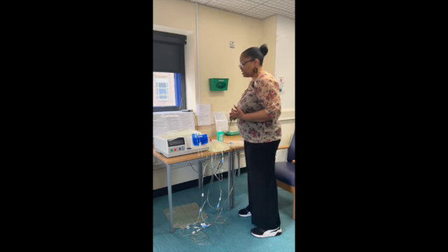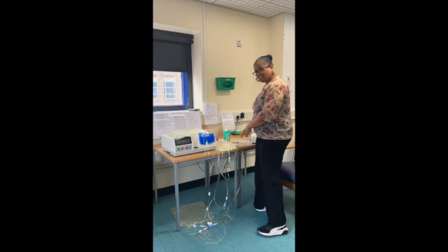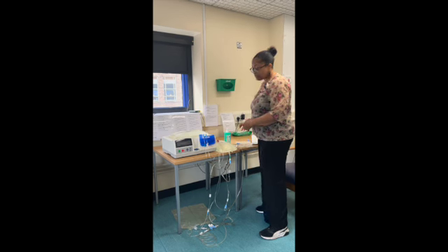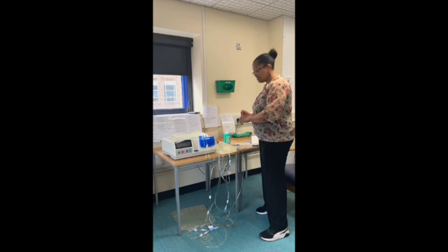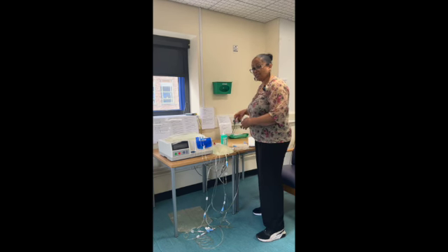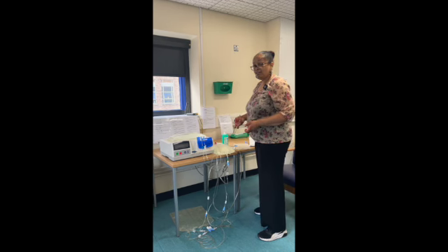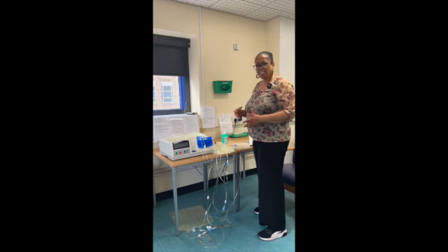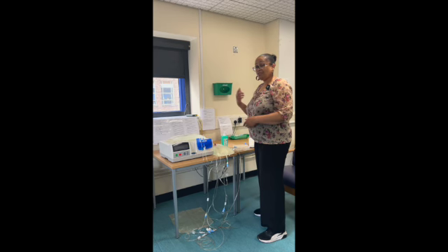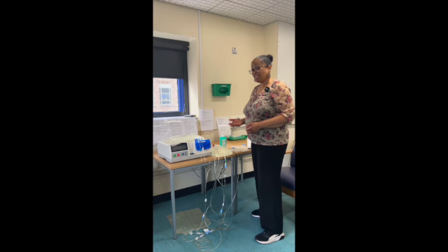So what happens is the machine fills the peritoneum. So imagine this is now my peritoneum. It sits within the peritoneum for about an hour and a half. That's the dwell cycle. And then the machine sucks out the fluid and all the toxins that are now in that fluid, and it repeats that cycle 5 times during the night, and the whole process takes approximately 8 hours.